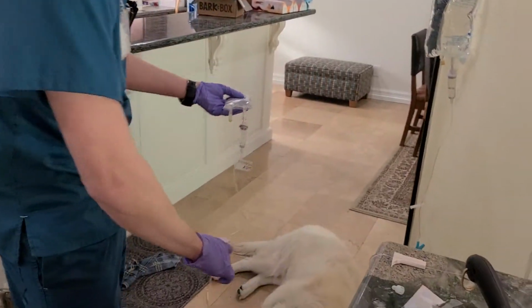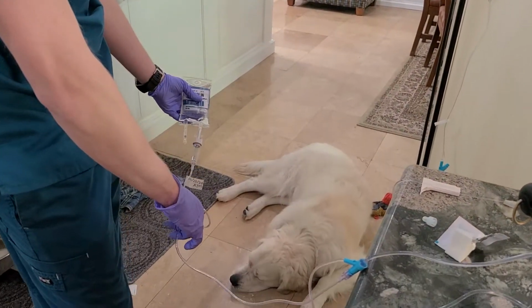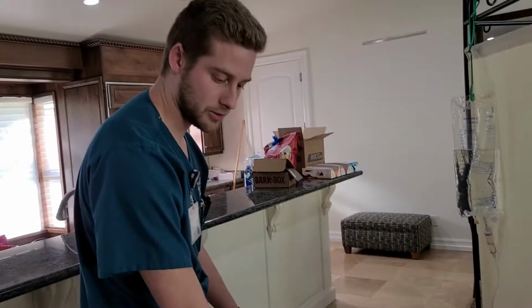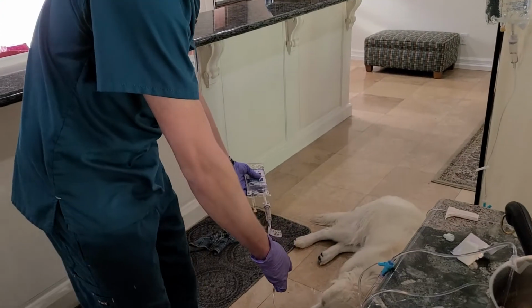And I would back prime until it fills up the chamber about a third to half the way full, and then I would make sure to do this until all the air bubbles are out. So I'm going to back prime.